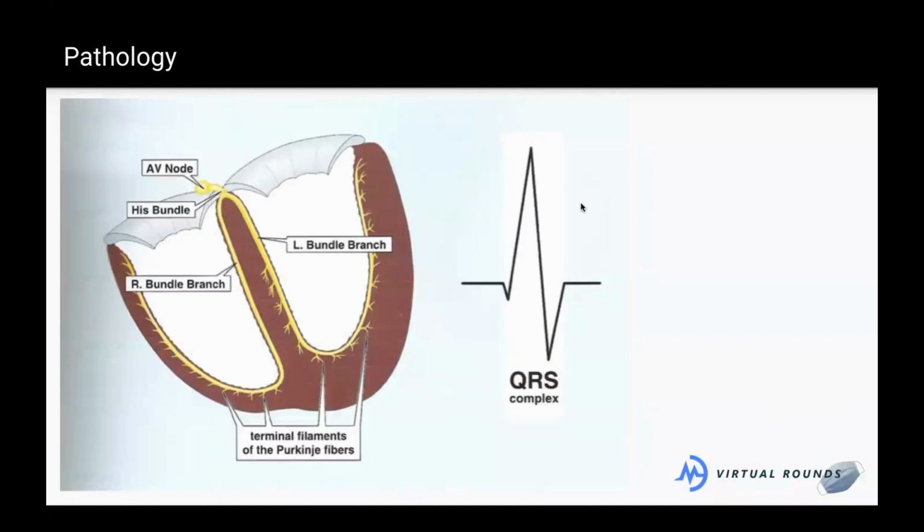So we have this thing called the QRS complex. There's a couple different letters here. There's P, QRS, and T, which are the ones that you need to know. The QRS complex is the biggest complex. When you see an EKG, you think of this big spike. The big spike is the biggest part of what's happening in the heart, which is when the heart muscle really contracts. And we care the most about this bottom part contracting.